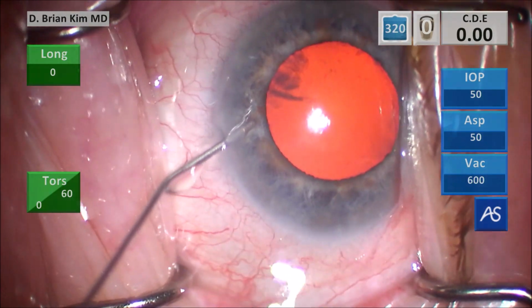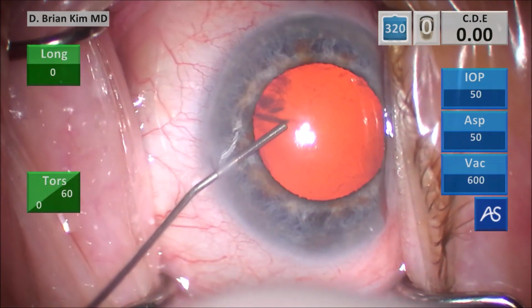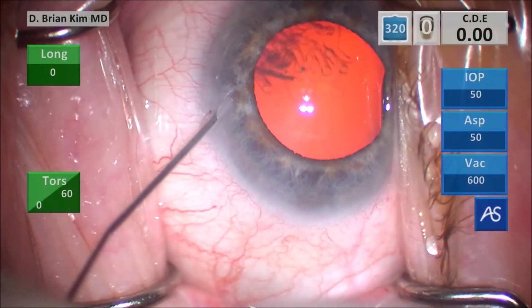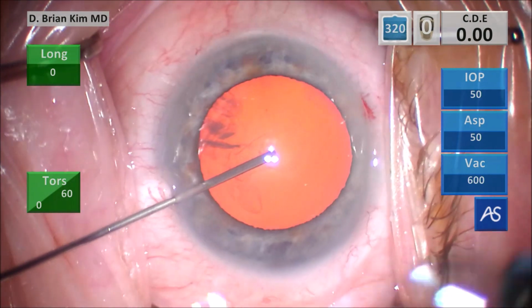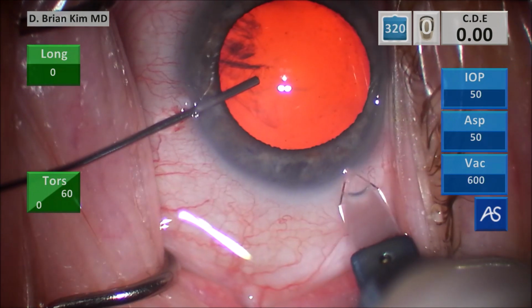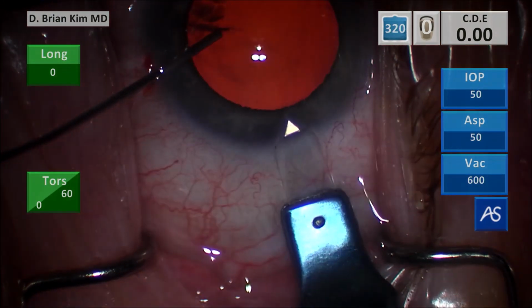This is some intracameral lidocaine and then some intracameral epinephrine to stabilize the pupil. And this is some dispersive viscoelastic to fill the anterior chamber and coat the corneal endothelium. So far, no indication for IFIS. This is the triplanar corneal incision. I make a vertical groove, place the blade into the deep part of the groove, tunnel, and then enter.